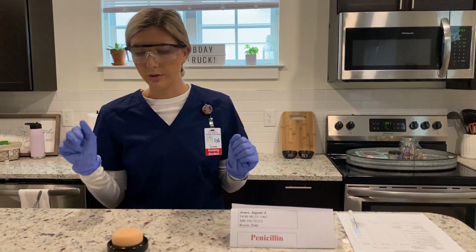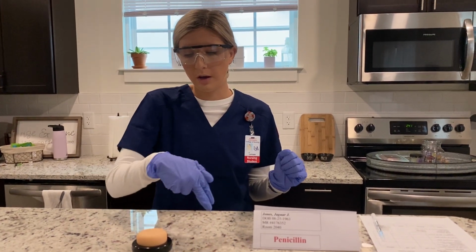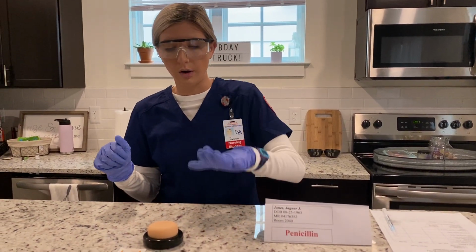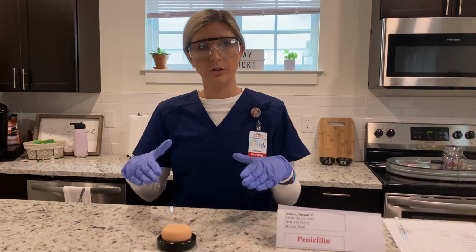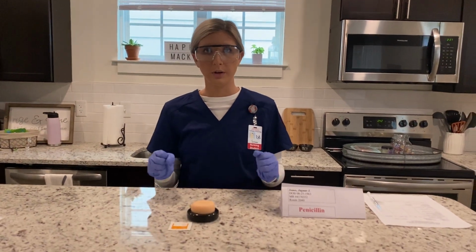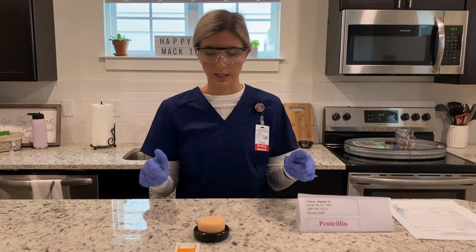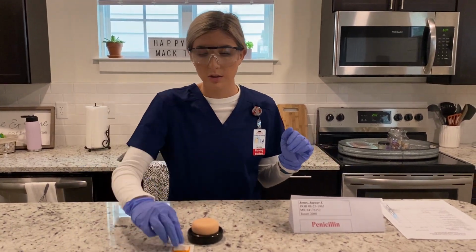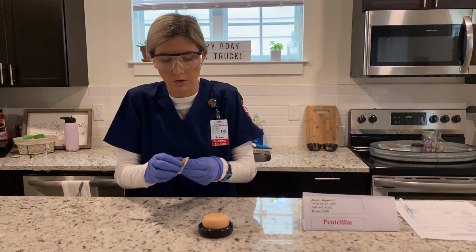So I'm going to go 2 inches away, all the way around from the umbilicus, and I don't want to go above the intercostal margin or below the pubic region, and I also don't want to go past the anterior superior iliac spine on either side. And then I'm going to check for any bruising or skin integrity, and I don't see any. So now I'm going to clean my injection site with an alcohol rub.